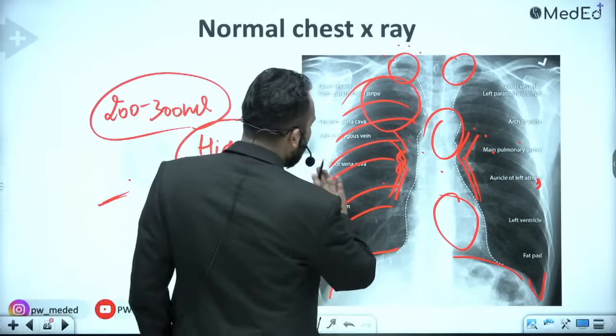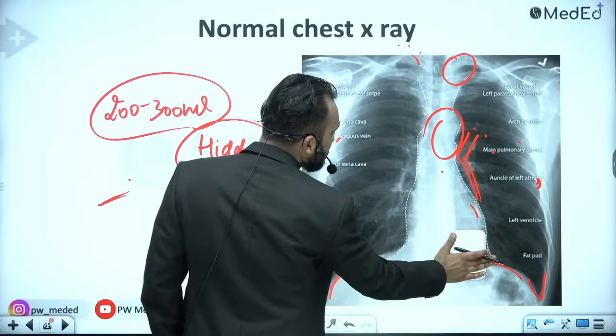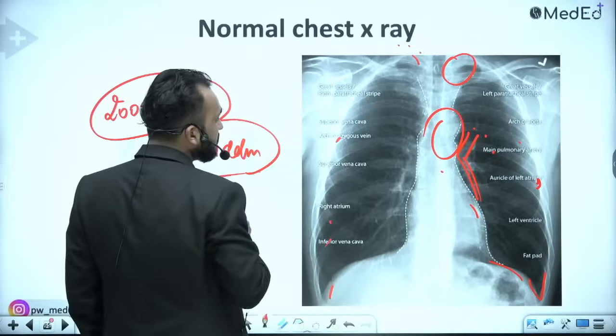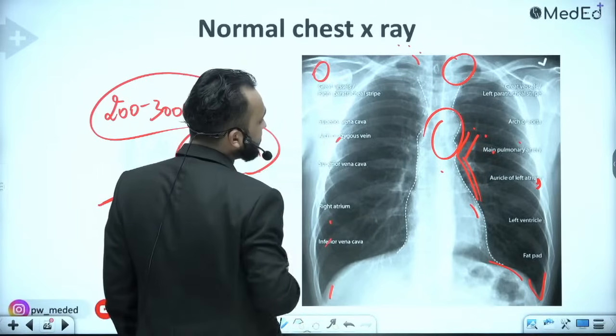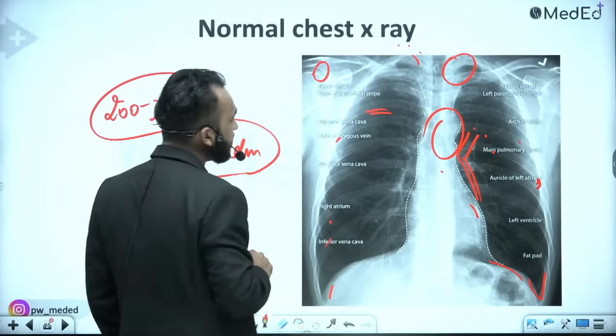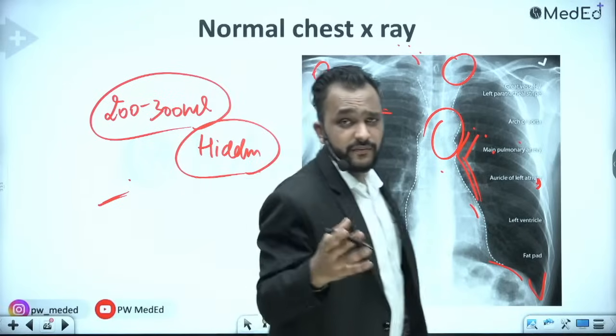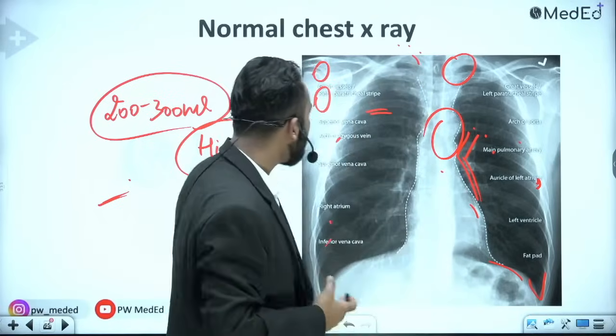So guys, when we are doing an X-ray, we will encounter 5 densities. These will include the density of air, which appears black. Then the density of fat, which will also appear black.